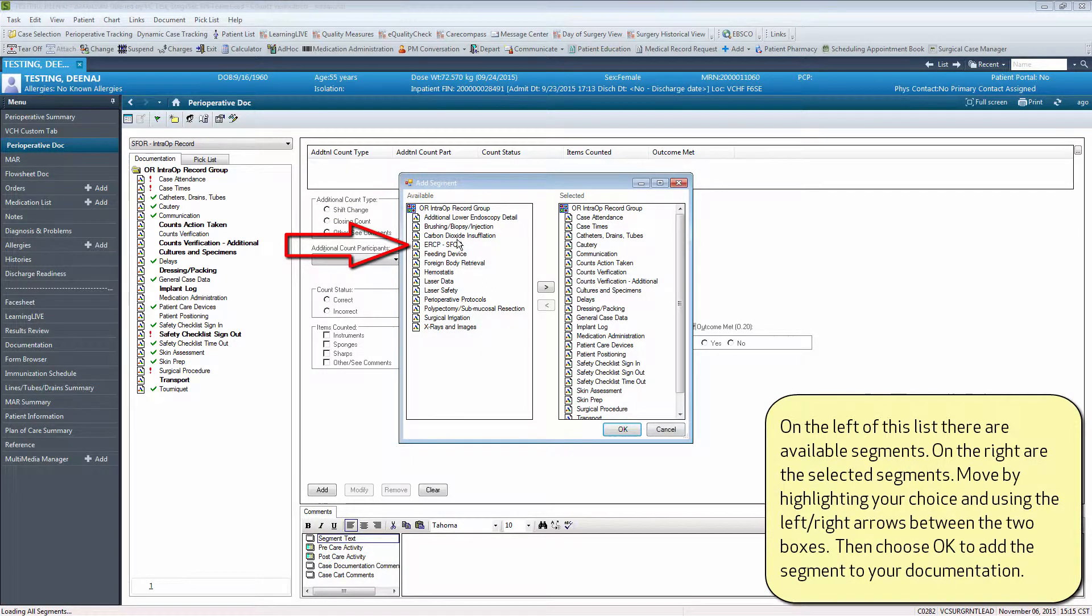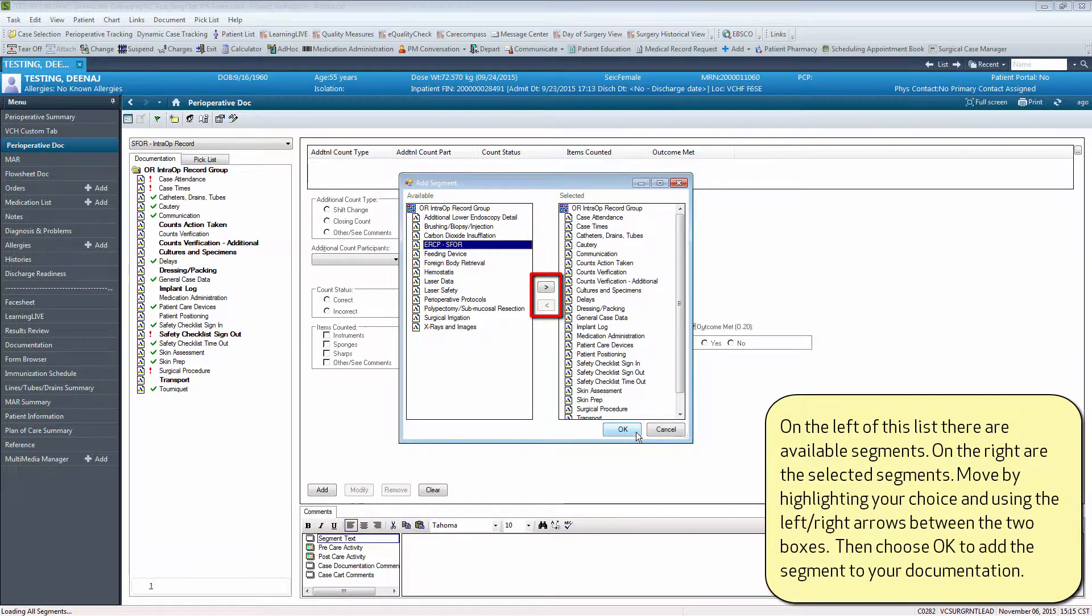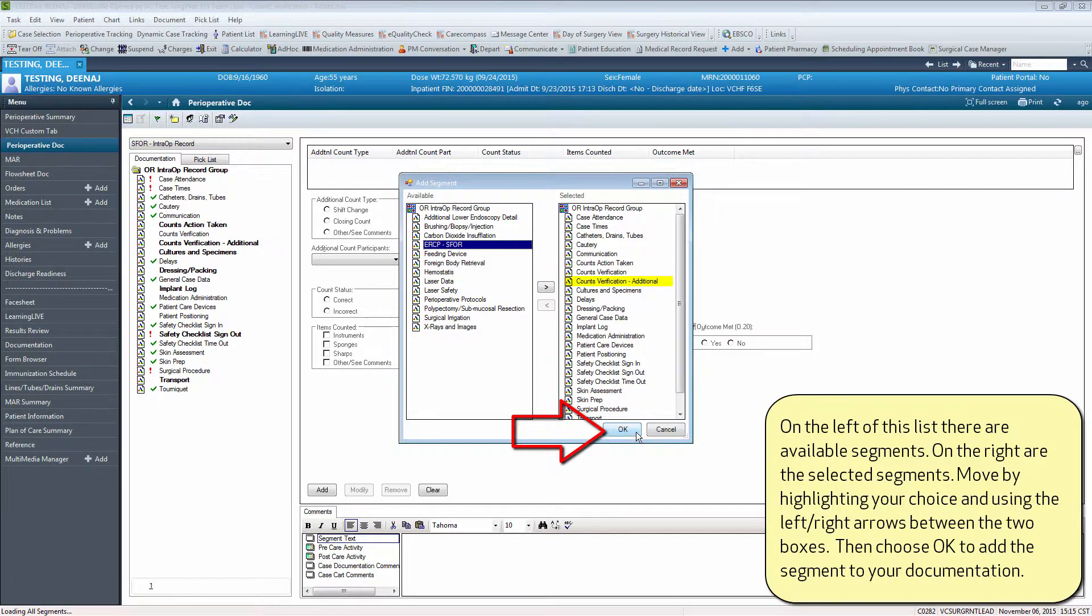On the left side of this list there are available segments. On the right are the selected segments. Move by highlighting your choice and using the left-right arrows between the two boxes. Then choose OK to add the segment to your documentation.